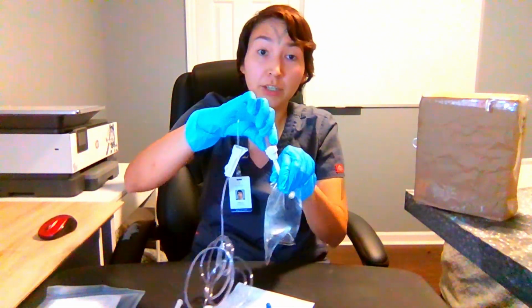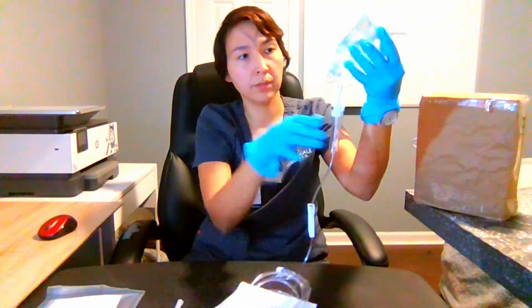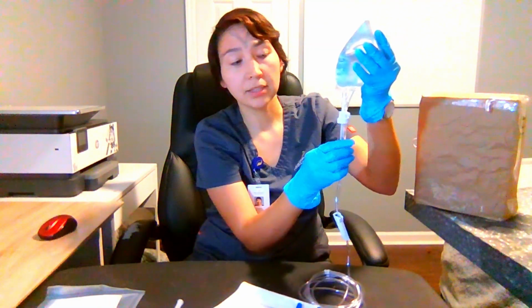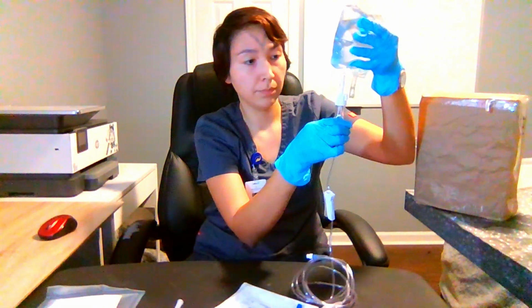Next, I will prime the tubing. I'll gently compress the drip chamber to fill halfway.